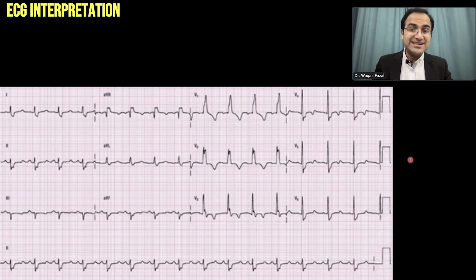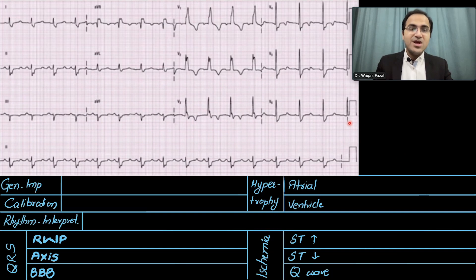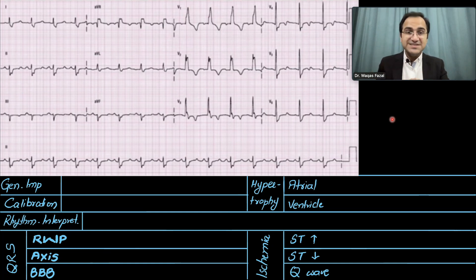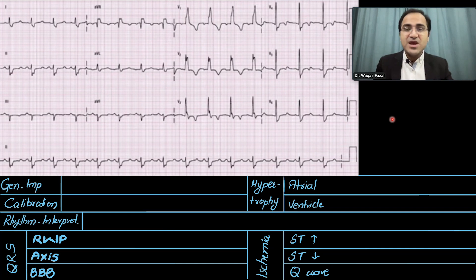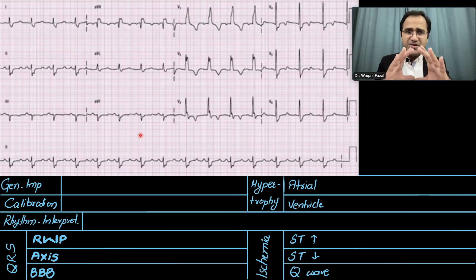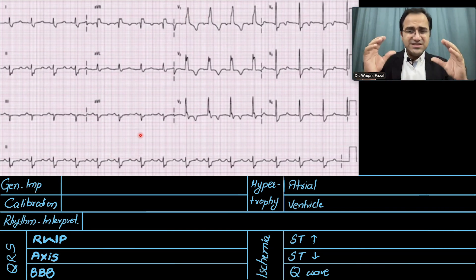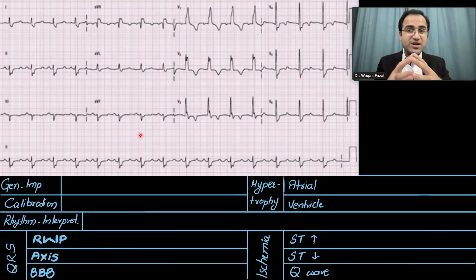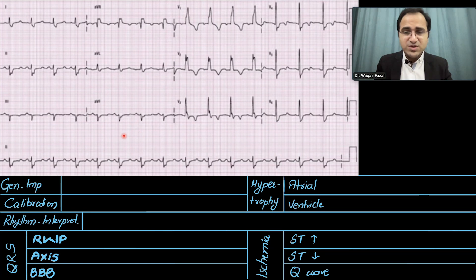Now look at this second ECG. You should pause the video and try to solve it yourself — until you practice solving ECGs, you won't retain the information. Now let's look at the general impression: the ECG does not look normal. It is not very fast, not very slow, but it looks ugly — the QRS complexes are wide.